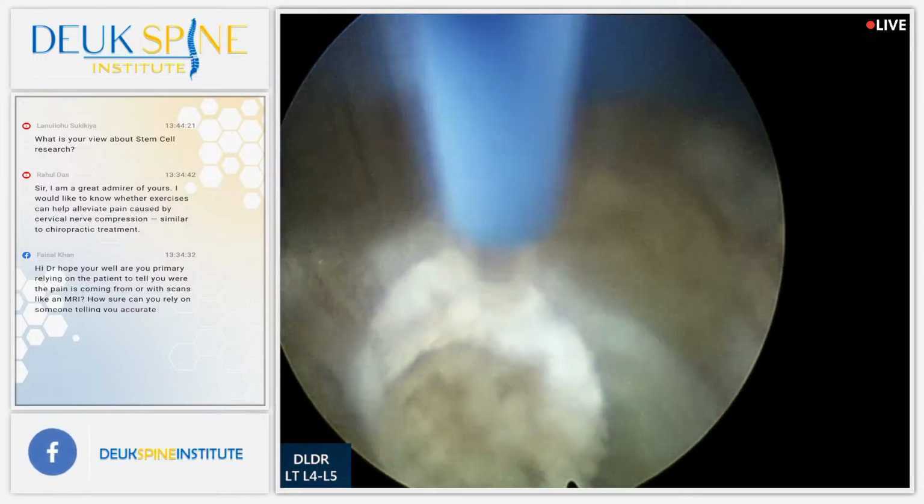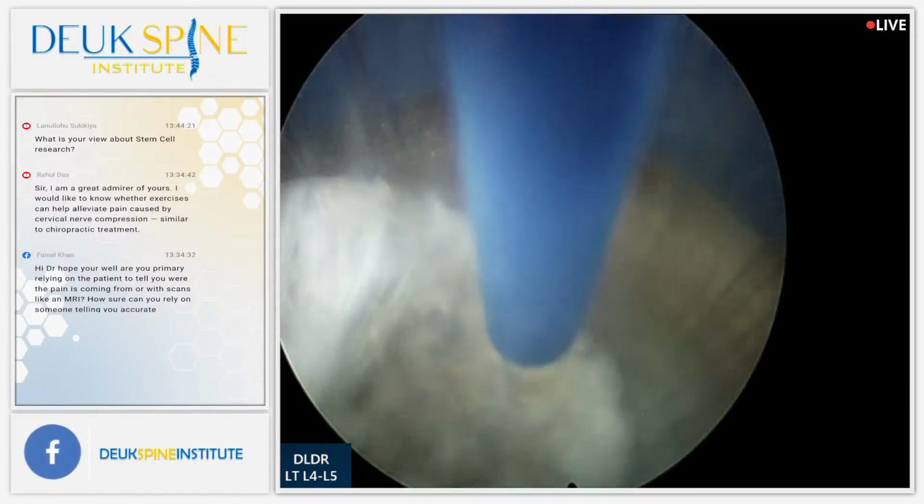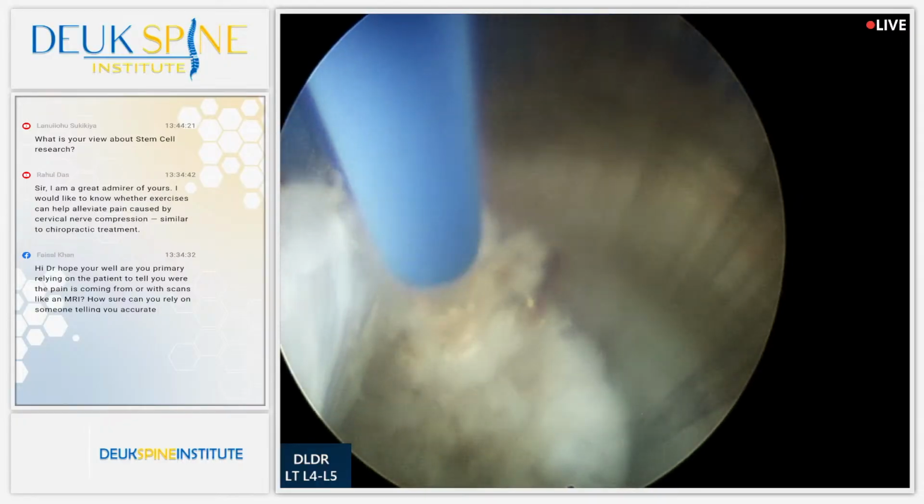All right, any questions? We're just about done here. We've shown quite a few videos. There's some inflammation right there. Yes. Henry, what questions can I answer?